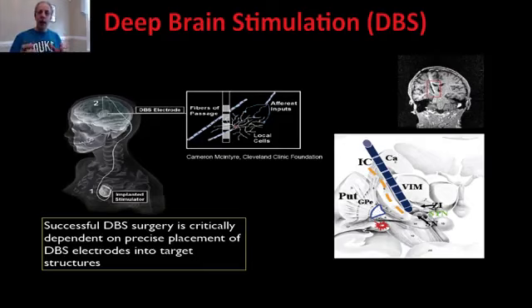The basic idea is that, as we see in this image, an electrode is inserted in the brain and pulses are sent. So the electrode is inserted, and there's also a generator that is normally put in the chest with a battery, and that generator sends electric pulses and basically stimulates a given region in the brain.